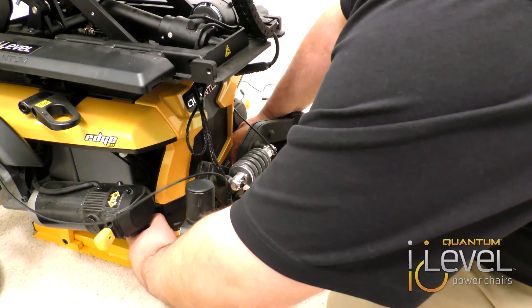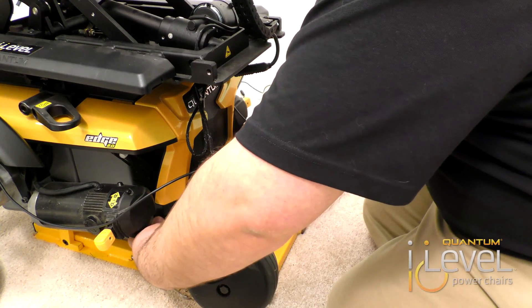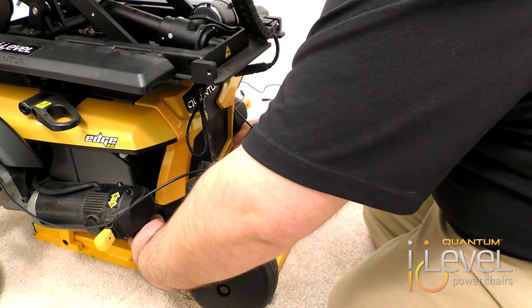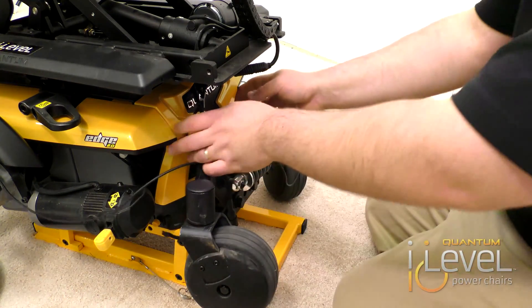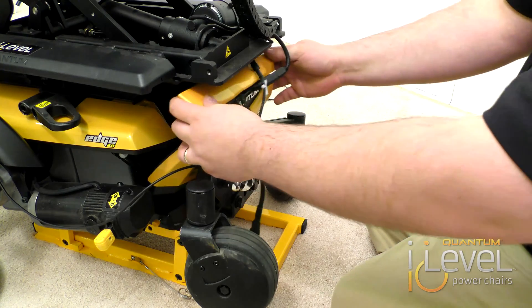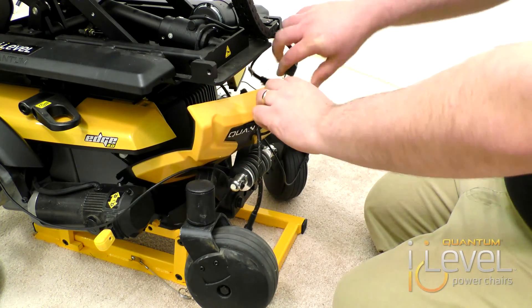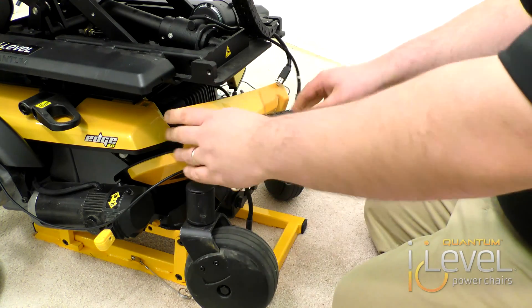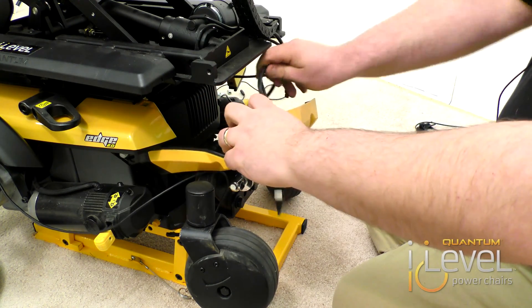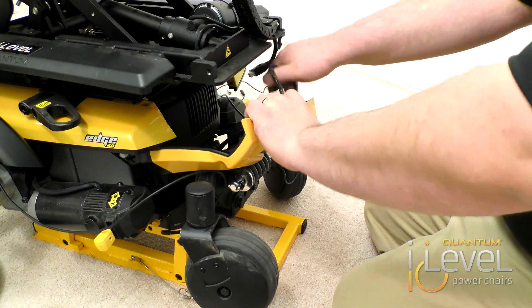Our next step is we're going to remove the thumb screws that hold the middle rear shroud onto the base. We take the rear shroud off, making sure we disconnect the harnesses going from your base to your seating system. Pull your wiring out.